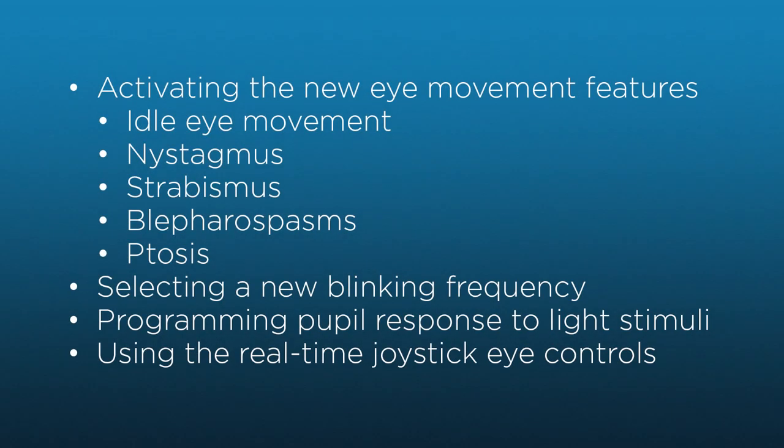By the end of the video, you should be able to understand and use the new eye movement features, change the blinking rate, program the pupillary reaction, and use the joystick eye controls for real-time movement.